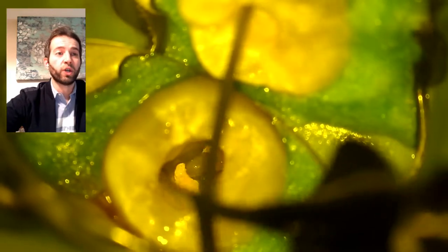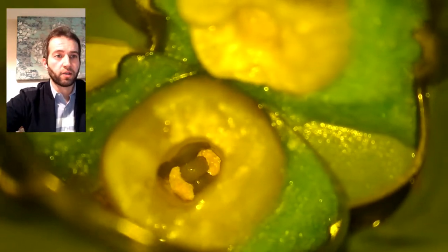After checking that, you go back with your regular bonding and etching protocol. I'm using a three-step bonding with Prelude adhesive. Then I micro-suction the excess bond to make sure there are no voids between the gutta-percha interface and the resin. You cure that and then you're ready to apply your buildup. I use a centrix tip — a very thin tip — to apply a bulk-fill core material. Under a microscope, you can see exactly where it's flowing to eliminate any voids, going incrementally and slowly to agitate any voids.